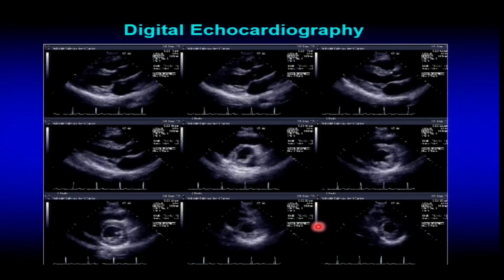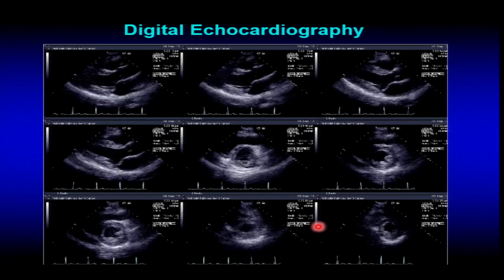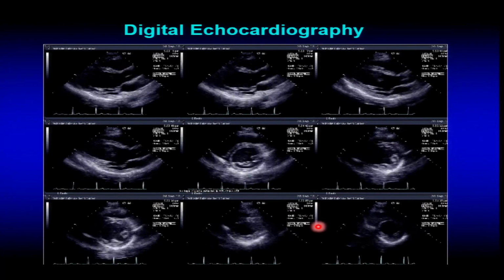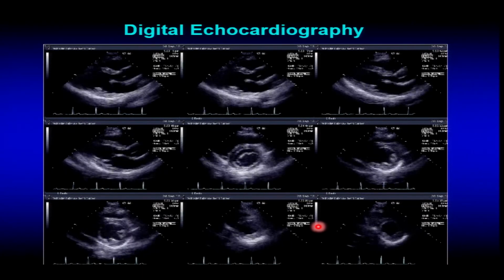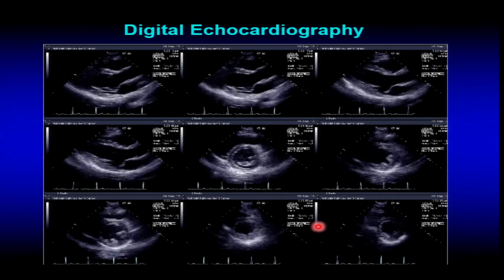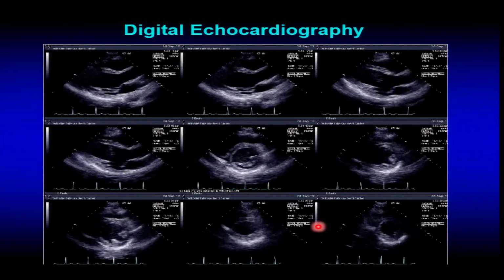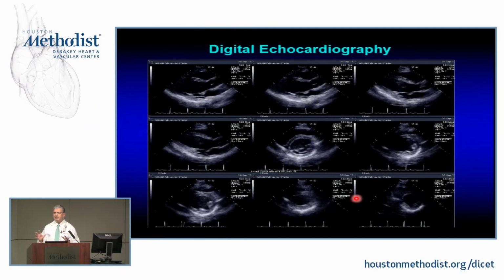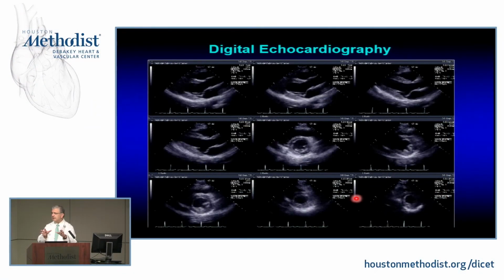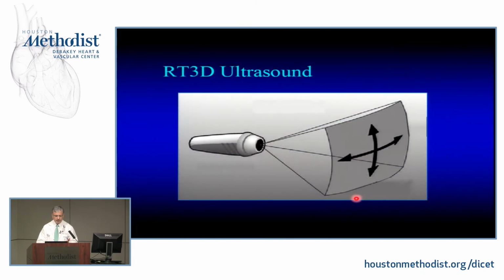I implore you to use as many of these in front of your eyes, because then your choice, your understanding, your interpretation, I know most of you use 4, I use 9, depending what you're comfortable with. But then I can scan what's going on in the heart and whether this image is foreshortened compared to the other, which one is giving me the best display, and then I can hone in and zoom on it and quantitate or interpret whichever way you want to do that. And I think that's beautiful.